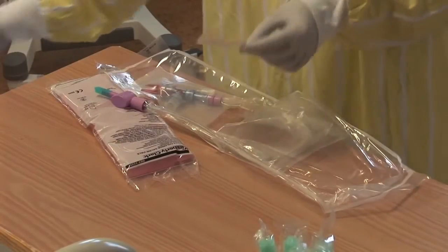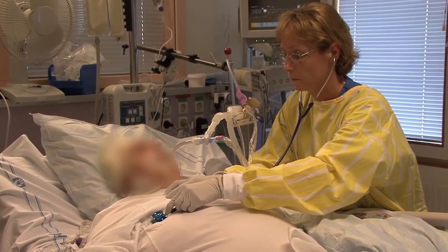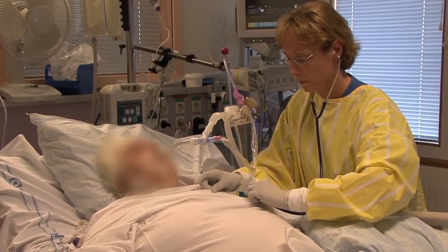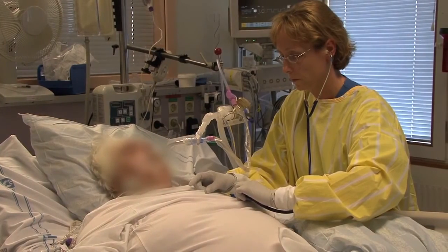Closed suction systems are packed sterile. After the closed system is in place, it becomes part of the ventilator circuit and should not be opened except as indicated on the directions for use. This includes aerosol delivery, continuous flow therapy and length of use. Always follow the directions for use to perform these procedures.